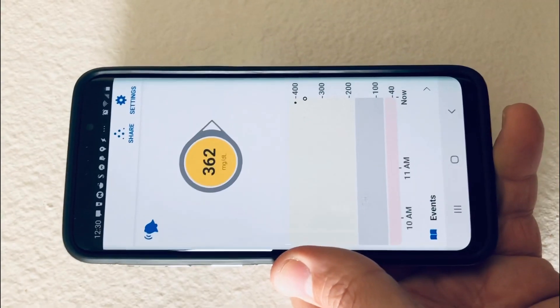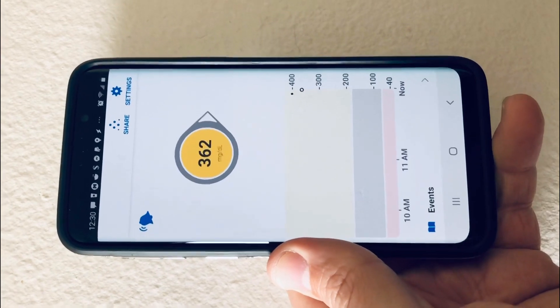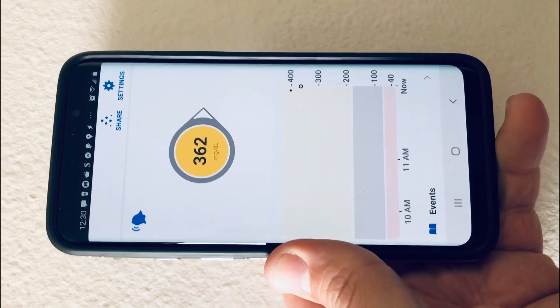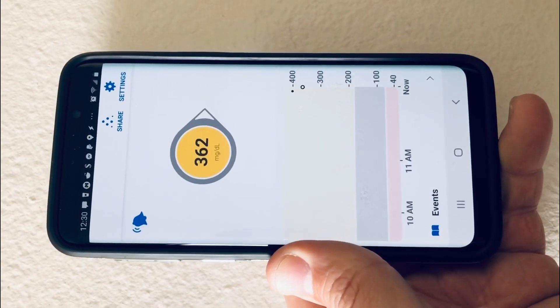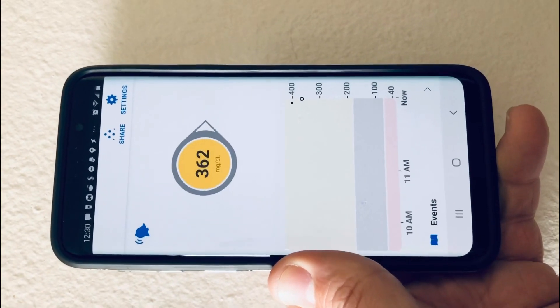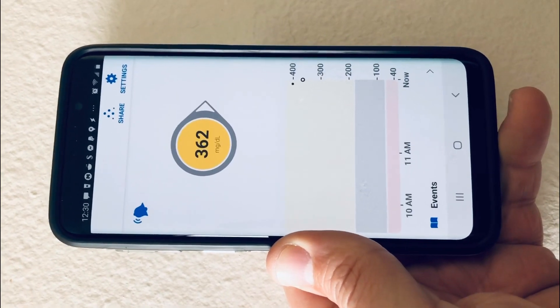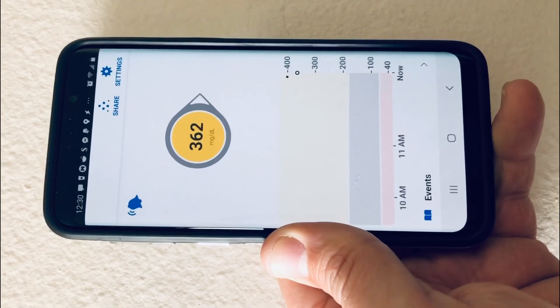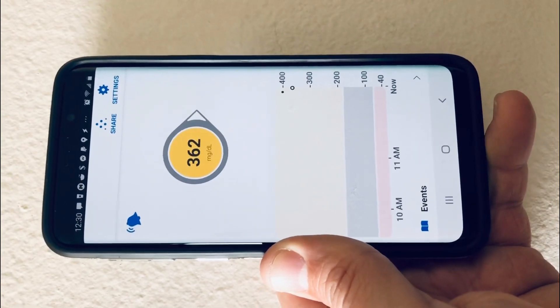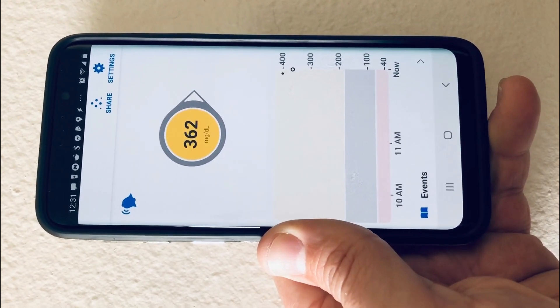It looks like the sensor is working to be reused on the Dexcom G6 using the method I just shared, which is pretty exciting. This is not good though — my sugar is extremely high. I am a very brittle diabetic and I'm unaware if I've got high or low blood sugars. Looks like I need to do an insulin shot right away. I did just test with a finger stick and I was at 360, so it looks like the reused Dexcom G6 transmitter is very accurate. I'm going to get a shot right now, but I just want to show you guys this reused transmitter is working.